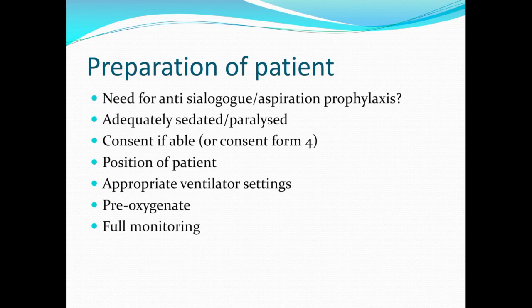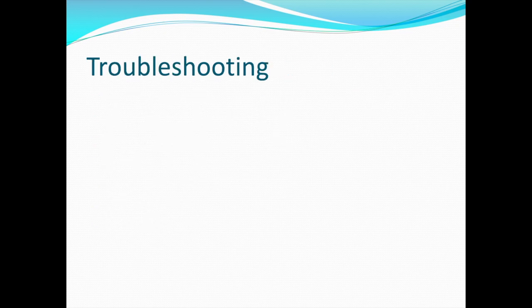And of course, ensure that the patient has full monitoring on. This is usually the case for most ventilated patients in the intensive care, but if not, make sure that you do that. Now I'm going to talk to you about troubleshooting.